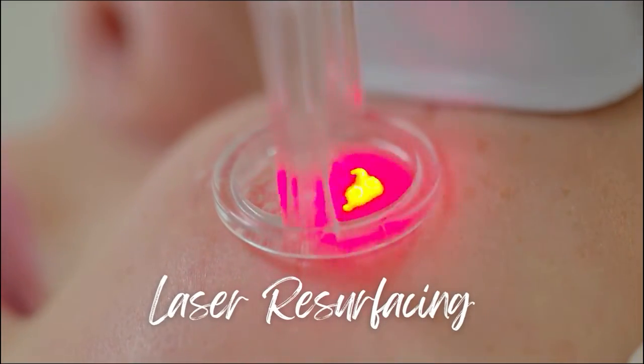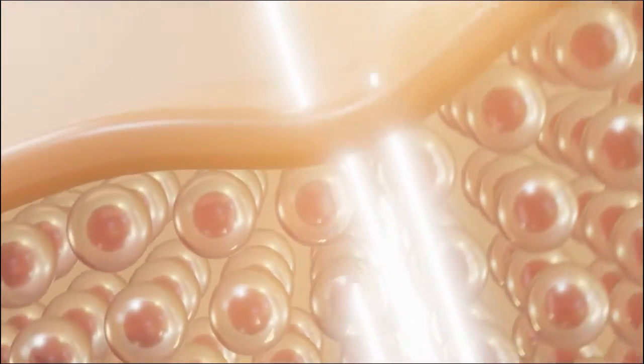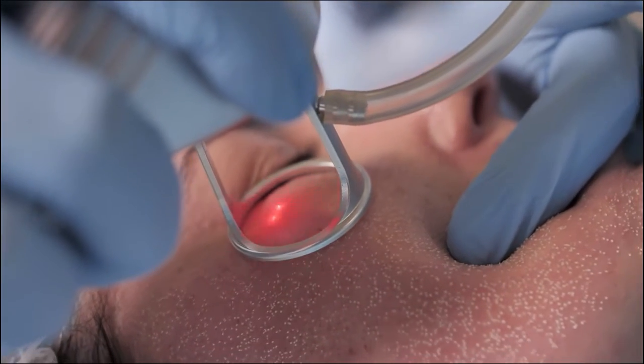We're doing this motion, you guys, as a theory called gate theory of pain. So the CO2 laser works by making tiny little microchannels, and what's going to happen over the next 6 months, this is the result. It just keeps getting better and better.